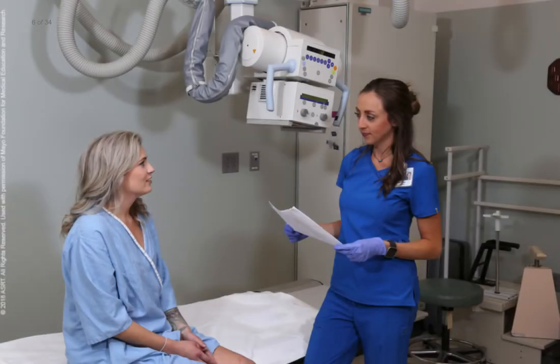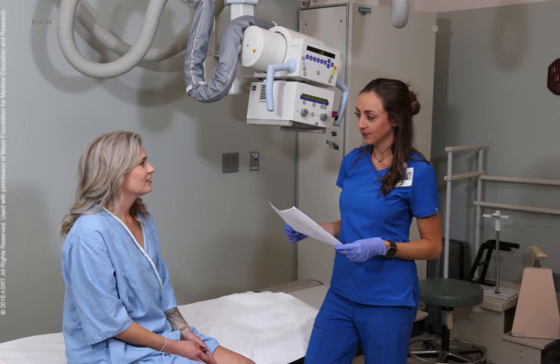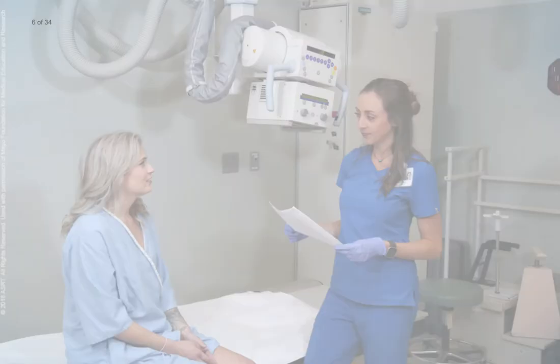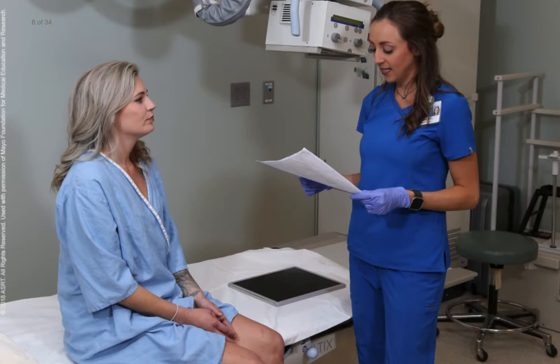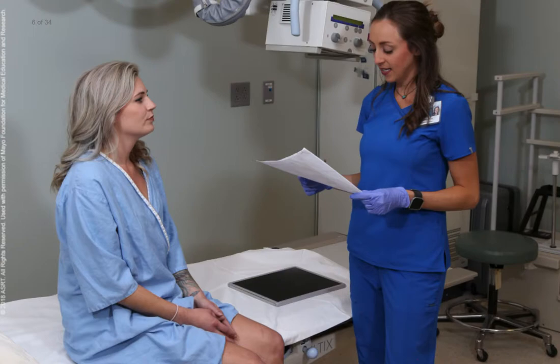Clear communication with the patient will ensure that a proper patient history is acquired and that the patient will comply with all instructions. It is generally good practice to explain the procedure before exam positioning so that any questions can be answered immediately. Patient history includes a discussion of any known anatomical variants and any medical devices implanted in the area of interest. For example, technical factors will need to be adjusted if a patient has a joint replacement or severe arthritis. Patients must remove all clothing in the area of interest, and if needed, are provided with a gown for privacy and warmth.